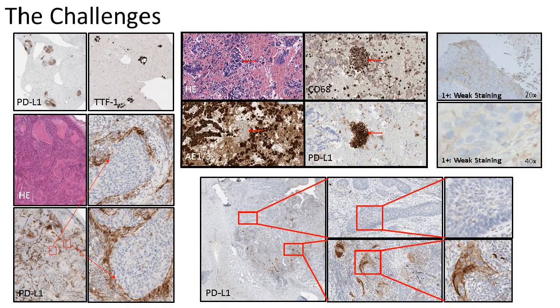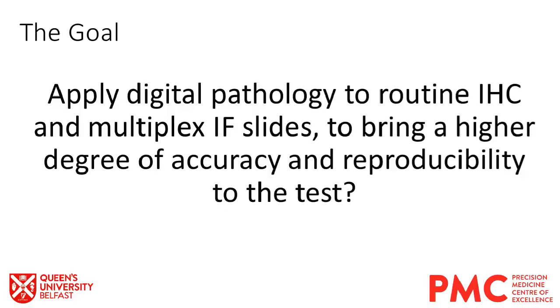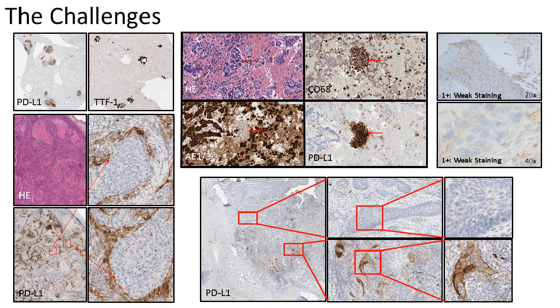So some of the challenges that we routinely see in the diagnostic service are low cell number. Sometimes there's a need for an additional stain, such as a TTF1 looking at adenos or a CK5/6 for squames. And this is really just to convince ourselves that there are at least 100 tumour cells within the sample.